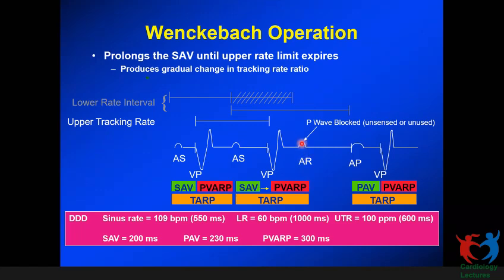Right? So now my patient is an AV block patient. This is a refractory atrial sense, so this will not start an AV interval and it will not deliver a ventricular pace. Now I'm sure you recognize what's happening. Normal AV interval with ventricular pace, extended AV interval with ventricular pace, one P wave does not result in a ventricular event. So normal AV interval, prolonged AV interval, one P wave without a QRS.